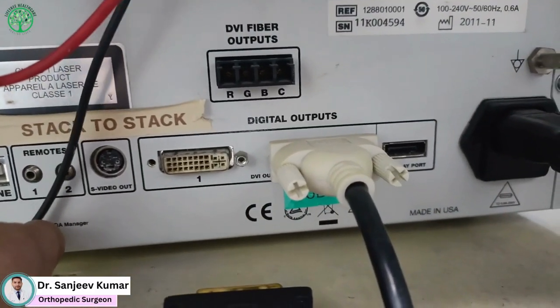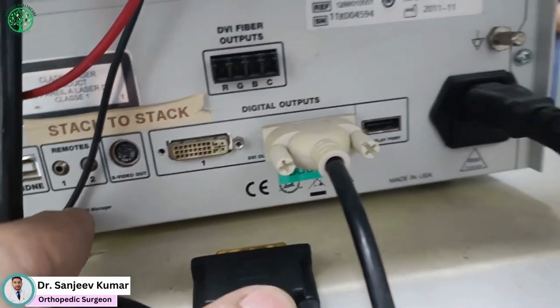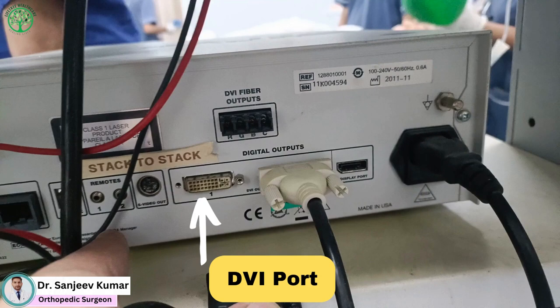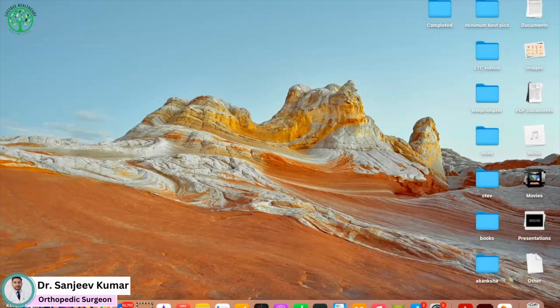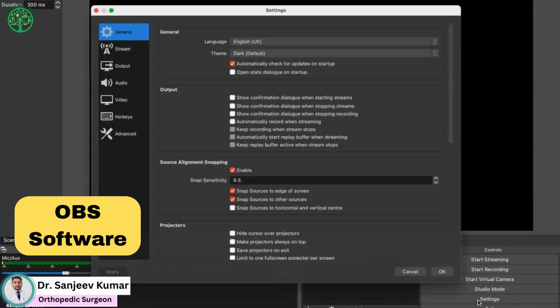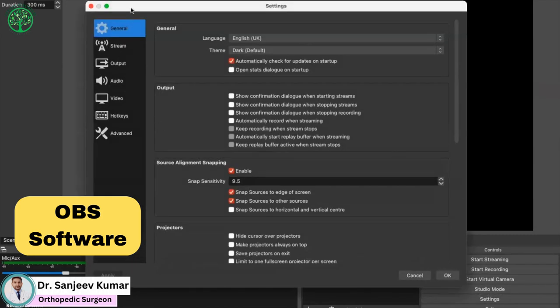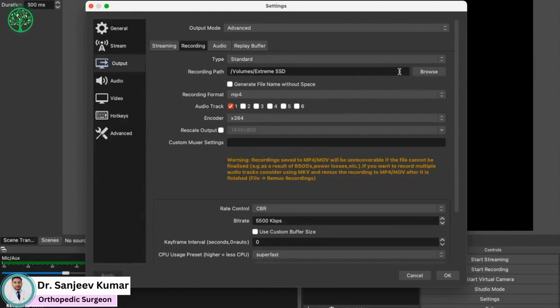Please keep in mind that you will need a different converter depending on the jacks available on the back of your camera. DVI is the most common, which is present on the camera. Install and open the OBS software, go to Settings, then in Output Settings go into the Recording tab. In the recording path, you can browse the location where you want to save your video.